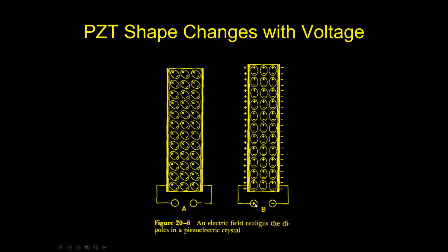On the other hand, if I pulse a pulse of electricity into it, so now I've charged it, all of these crystal elements line up together. And if you notice the difference here, the crystal has now become longer and skinnier than when it doesn't have an electric charge.